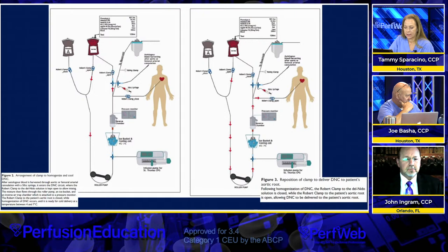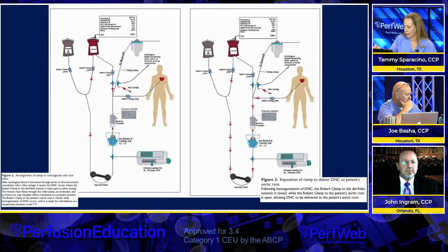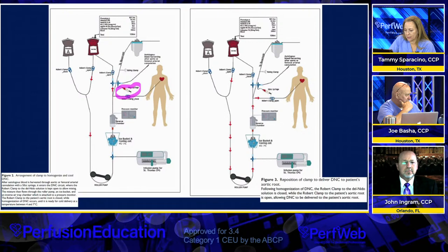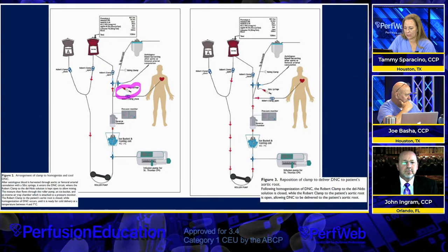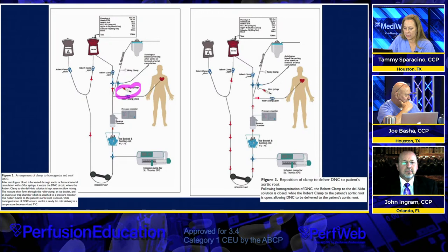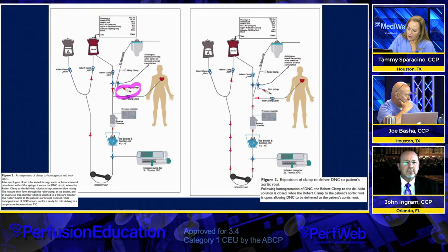So, real quick, let's get a good color here. I like that one. All right, so what you've got here is this part that is kind of interesting. It's a syringe that they're using to get blood from the patient and then infusing it into their cardioplegia circuit. Because you can see now that we don't have a... let me read how they word it here.